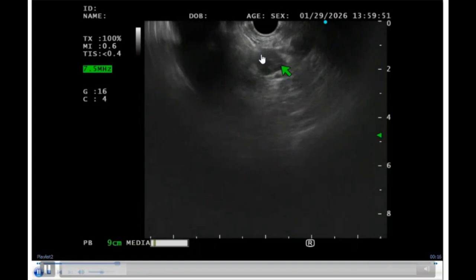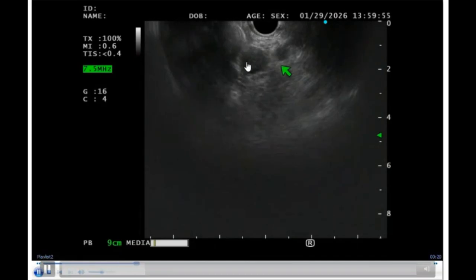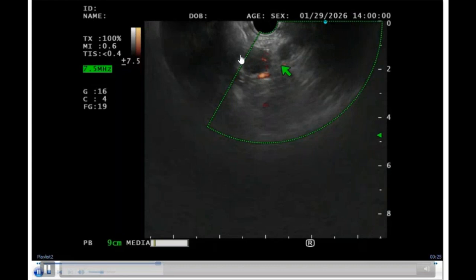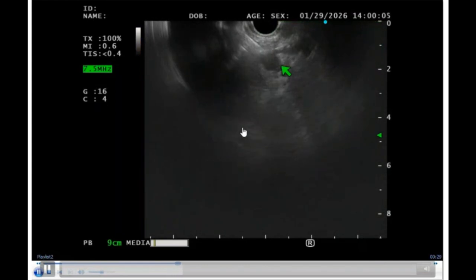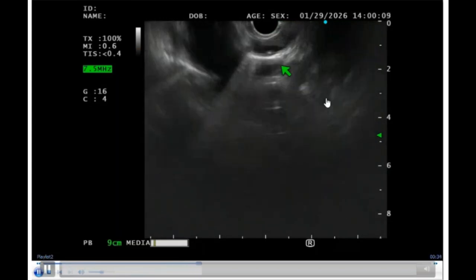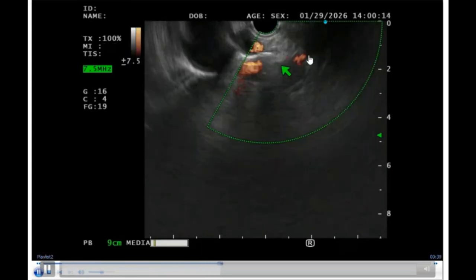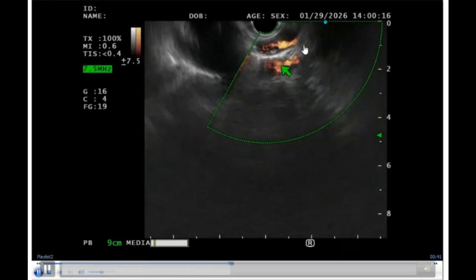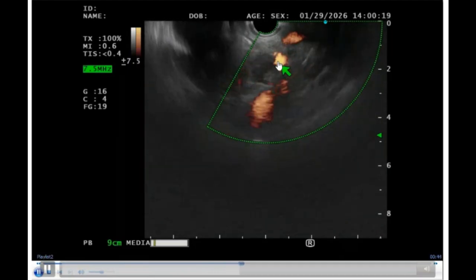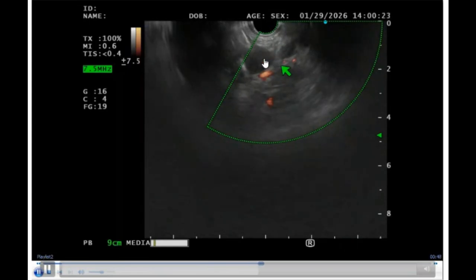And obviously, when you're in this area, the one thing that you have to be careful is to make sure there is no aberrant vertebral artery takeoff, from the early takeoff of vertebral artery from the left subclavian. Here you can see the lymph node. I'm trying to see if there is any vessels close to the EUS window here.